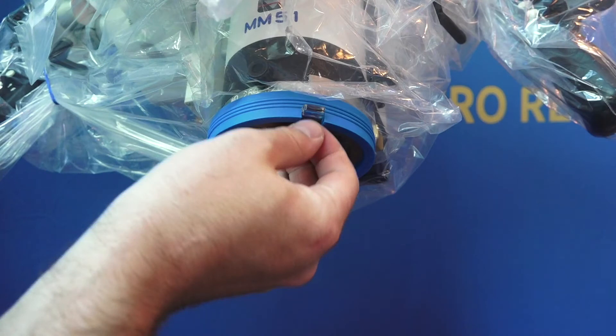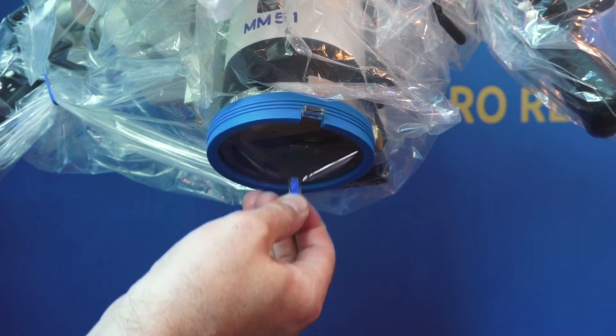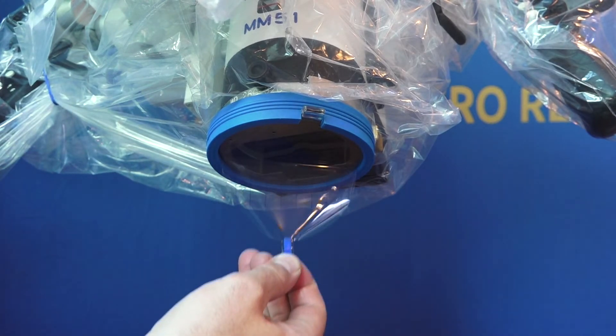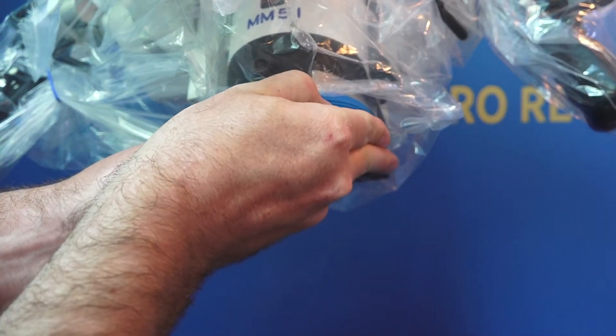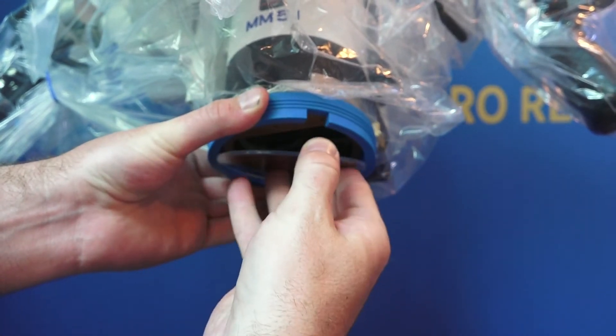The final task when draping this microscope is one of the most important. If the lens cover is to remain on during the procedure, it is imperative that the thin plastic film covering it be removed. However, we recommend that the plastic cover be removed completely before surgery. This ensures the highest optical performance of this microscope necessary for super microsurgery.